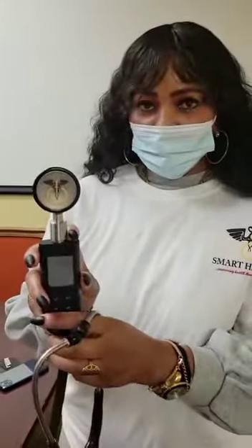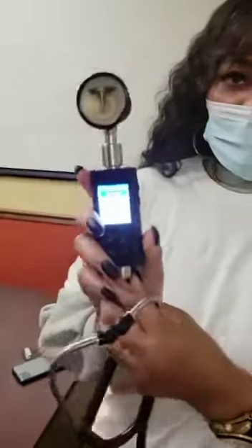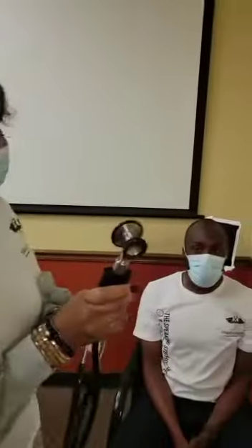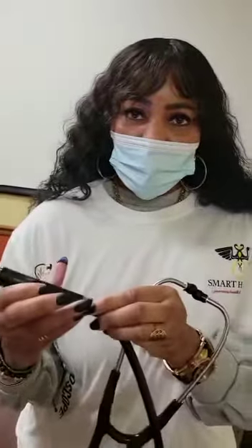First I'm going to turn the device on. As you can see, heart — we're going to listen to his heart. We're going to press the record button on the side.